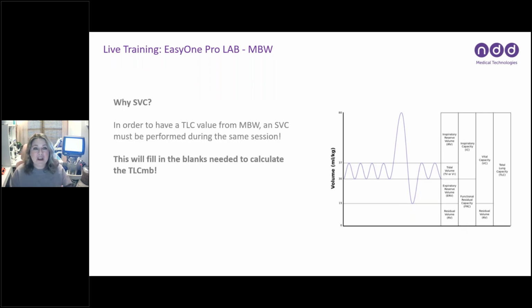All right, one question that we get, I think more than any other question when it comes to the multiple breath washout test, is we will have people call into support. You'll call your regional director or your sales representative and say, you know, we're doing multiple breath washout. We're missing our TLC. Our TLC is not calculating. And so the first question that we always ask is, did you perform an SVC test or a slow vital capacity test? And if the answer is no, then that's absolutely why you didn't get your full values for TLC.